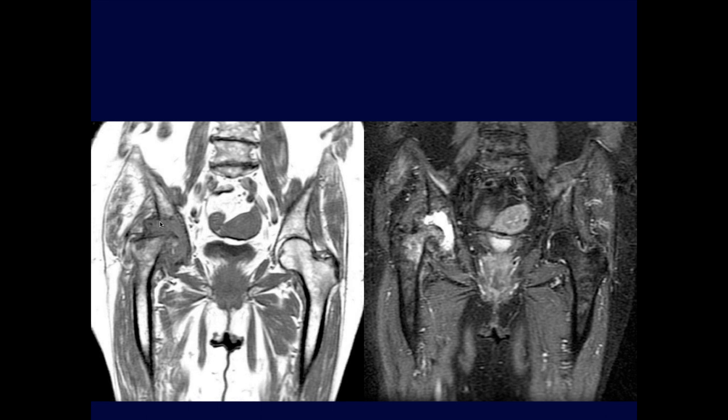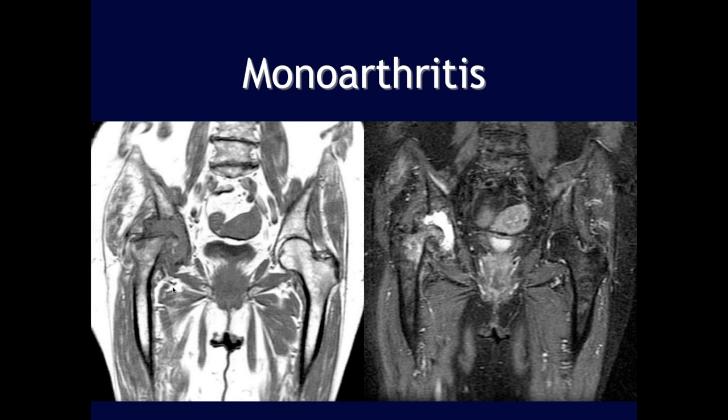On coronal imaging of the right hip, the femoral head looks quite deformed with a large effusion and remodeling. There's atrophy within the musculature bilaterally. This looks like focal degenerative change — mono-arthritis. This was actually sequelae of chronic joint infection that was not properly treated.